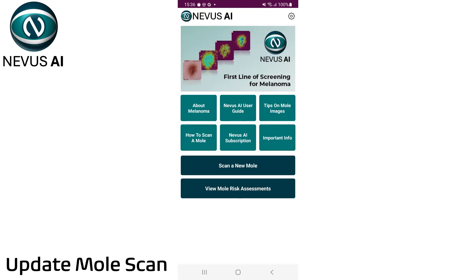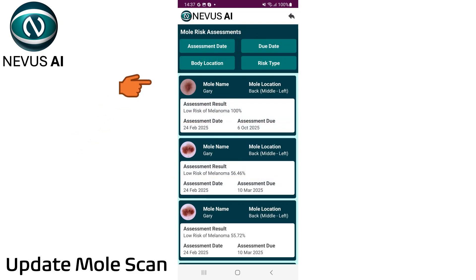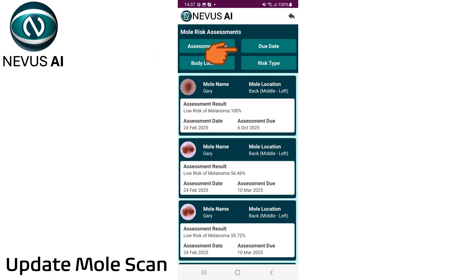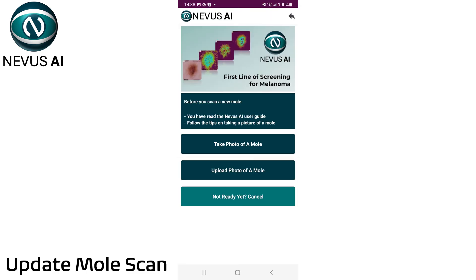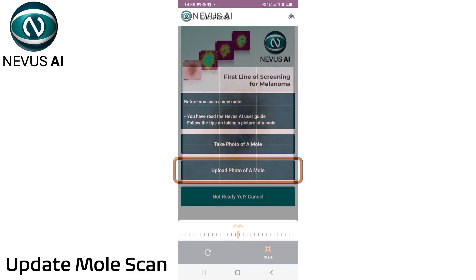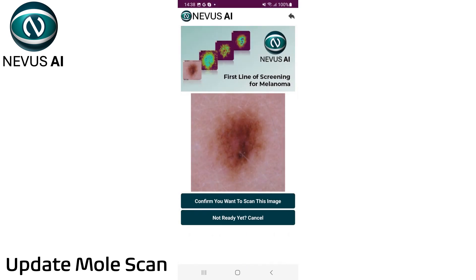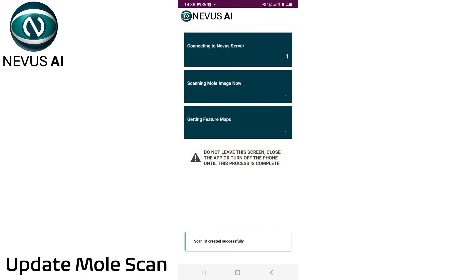You can view your previous mole risk assessments from the home screen. Filter previous assessments in order of the assessment date, body location, the assessment due date, or the risk type. Then select a risk assessment to view. To update a scan with the same mole name, tap the plus button at the top. Then follow the same steps to select or take another image of your mole. After selecting the image you want to use, tap confirm to send it to the Nevis AI server. And then wait a few moments for the next mole assessment.